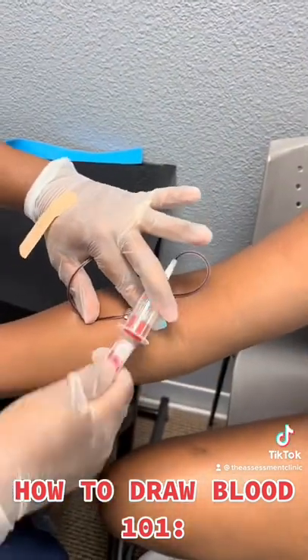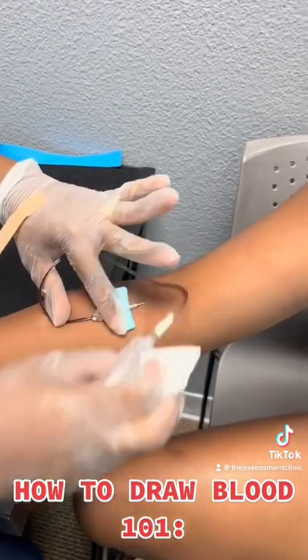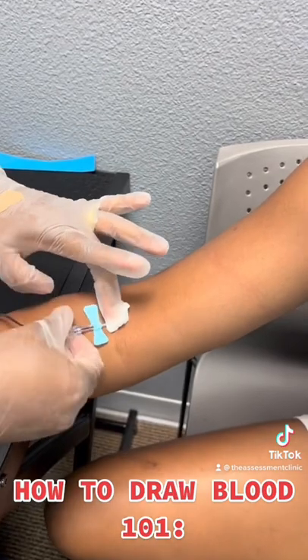Remove the tourniquet, remove the vacutainer and invert a few times. Apply some gauze over the needle, then remove.